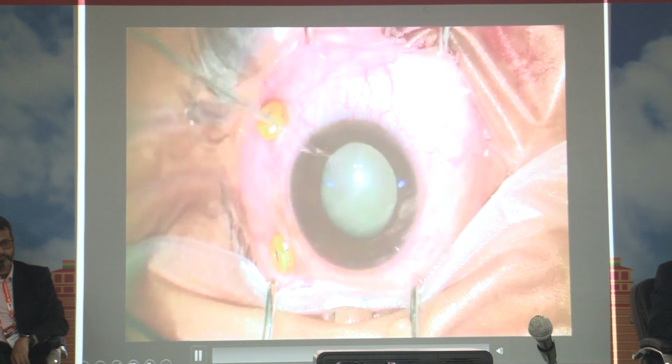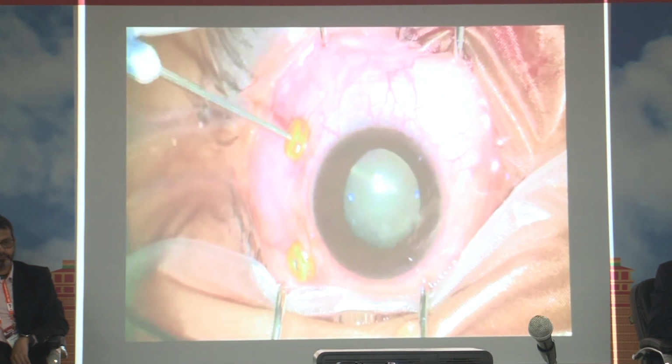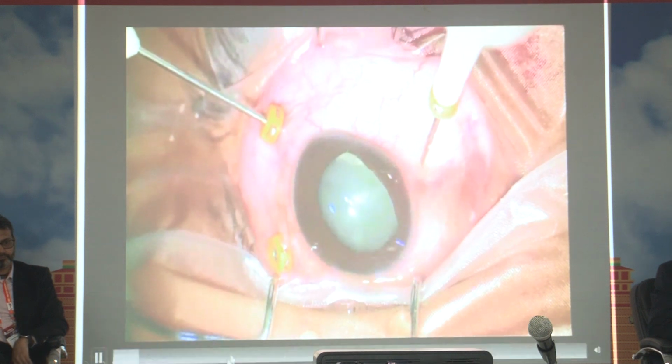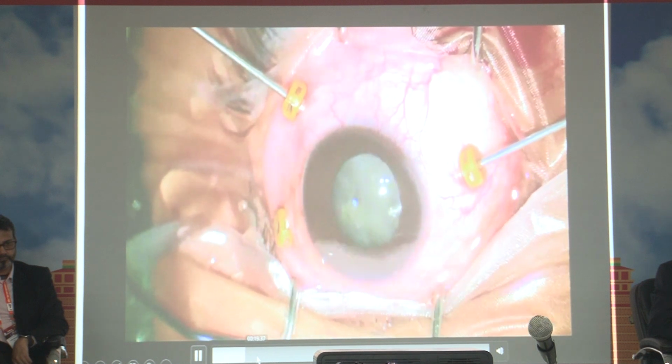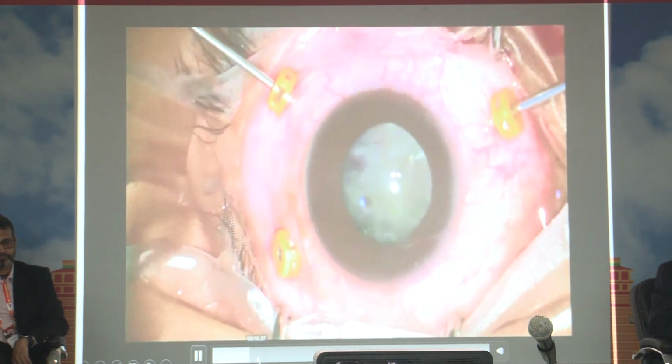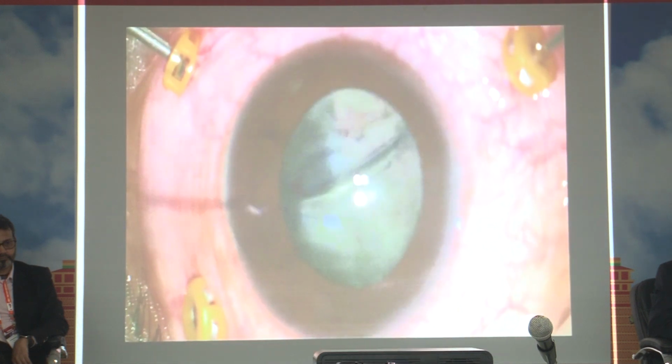This was just the last 30 seconds I'll take, sir. Extremely sorry. So this was a case who was admitted to the blind school. He was a 14-year-old boy. And when we do the yearly blind school follow-up, so this was the case. Almost the retina was seen behind the lens, as you can see here.